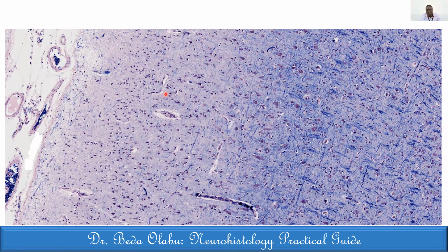As you move from left to right of the screen, the cells on the left extreme are tinier, and the cells on the right extreme are slightly bigger, or at least they increase in size to some level.